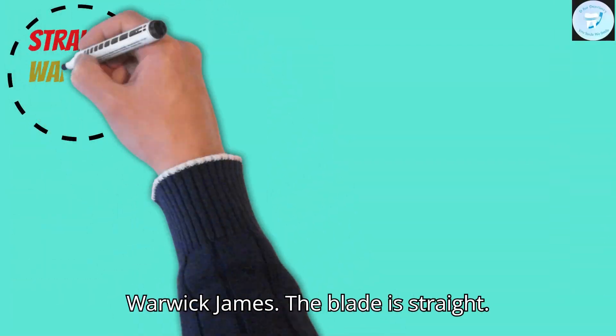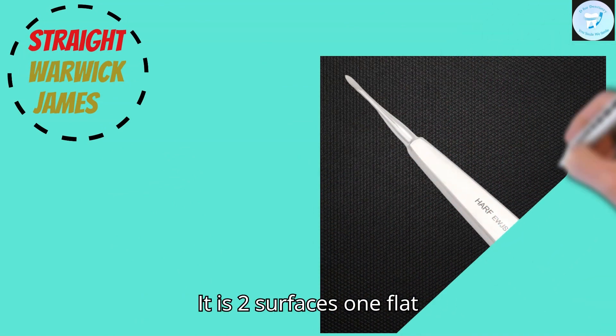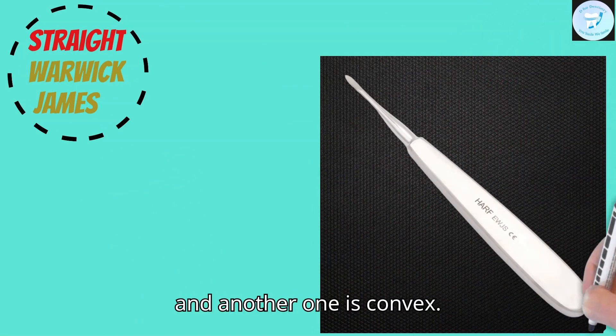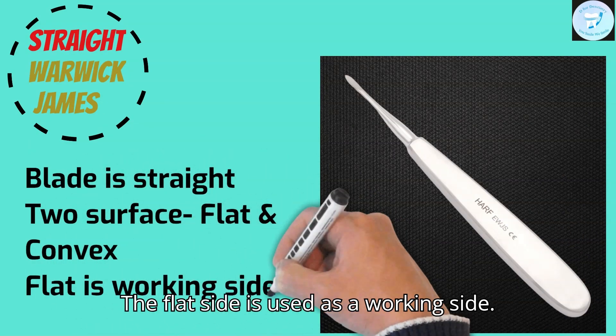This is the straight Warwick James. The blade is straight. It has two surfaces: one is flat and another one is convex. The flat side is used as the working side.